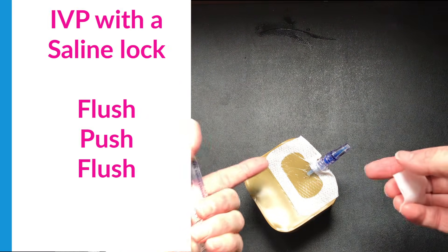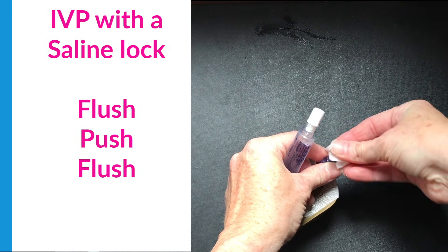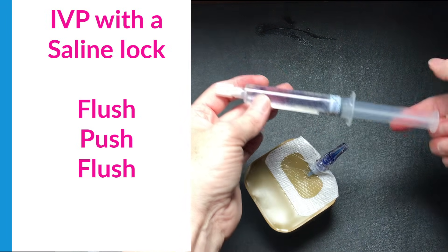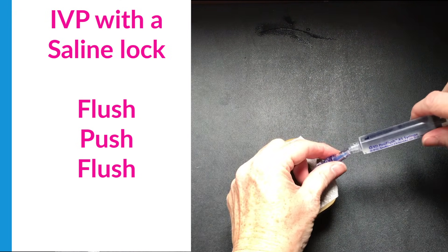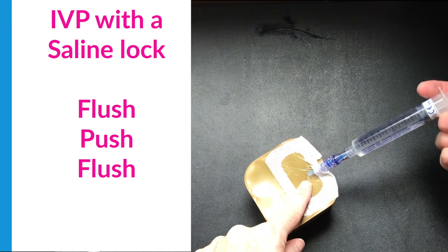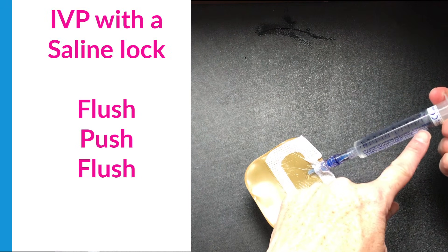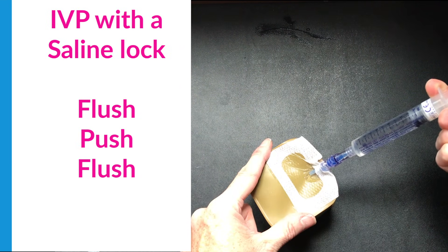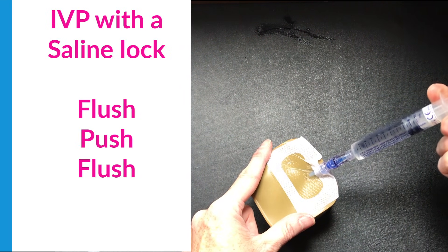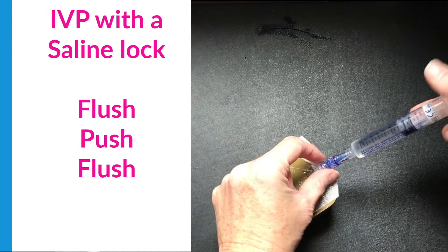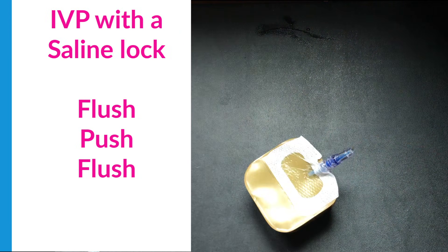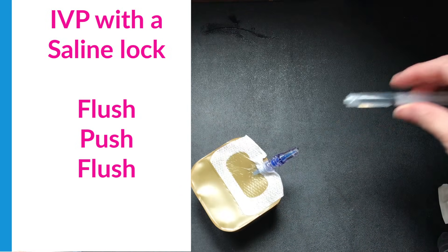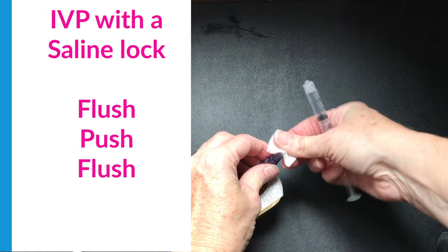If my patient just has a saline lock, I'm going to clean the hub again for 15 seconds. I have a saline flush and I'm going to flush first to make sure the IV is patent — I only need 3 mils for this. I push with positive pressure and it shouldn't be resisting. Once those 3 mls are in, I discard that syringe. Now that my line is flushed and patent, I can go ahead and give my medication.